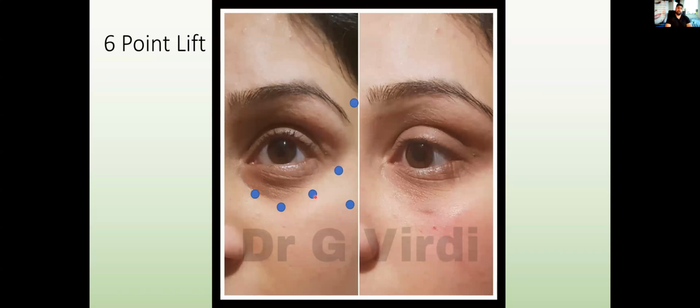And then my third point of injection is back here at the medial aspect of the tear trough, again injecting with a needle down onto periosteum. Now it is a very high-risk area given you've got the angular artery and the angular vein, and there's always anatomical variation and differences.